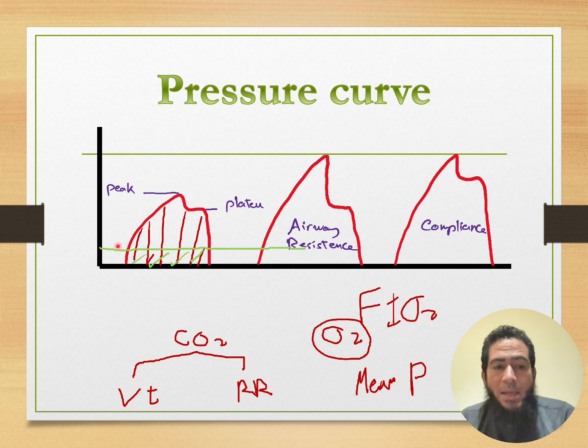So the airway pressure, which is the peak, is not directly related to any barotrauma or volutrauma. It's the plateau pressure. So that's also another advantage of the plateau. Okay.